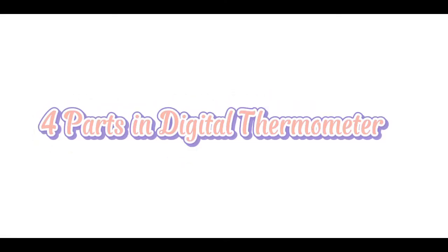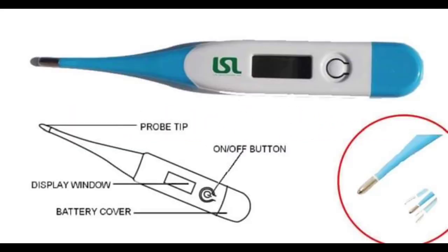There are four parts in a digital thermometer. First, probe tip. Second, display window. Then, on and off button or power button. Lastly, battery cover.